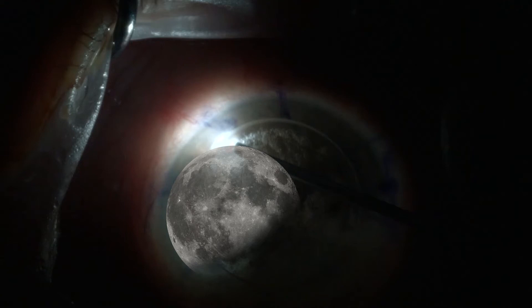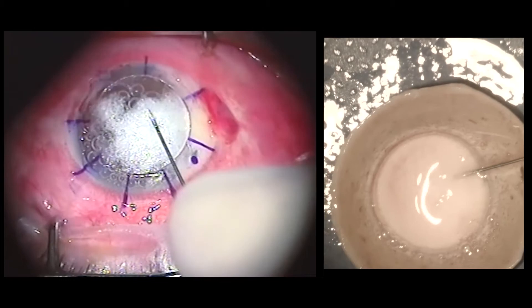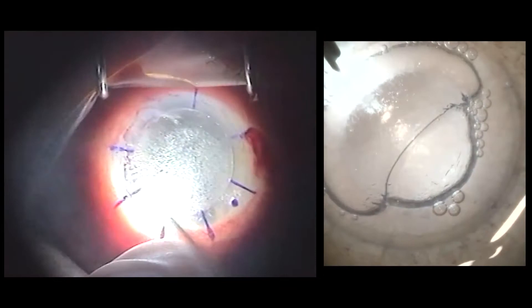In some other cases the air goes over and under the Dua's layer, which is defined as a type 3 big bubble. An image taken on a research cornea shows the mechanism of this type of bubble. When we check with the transillumination technique we can see two bubbles.